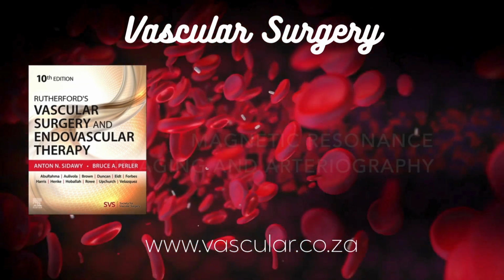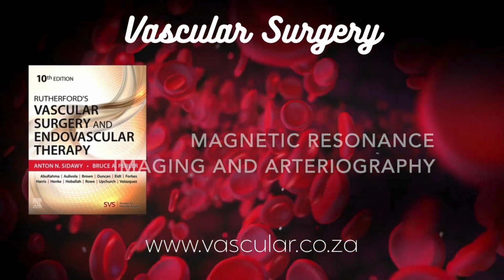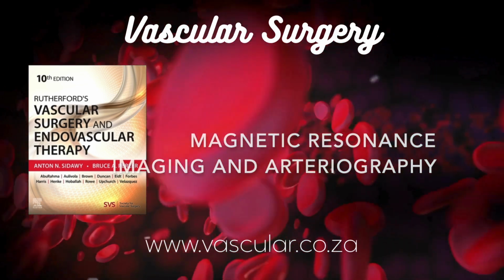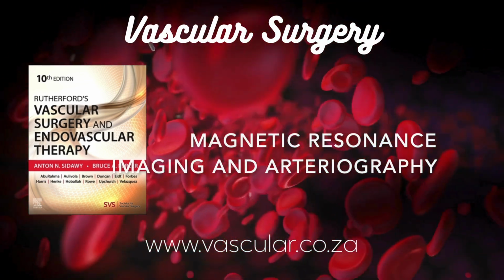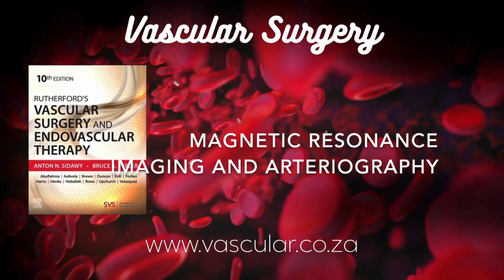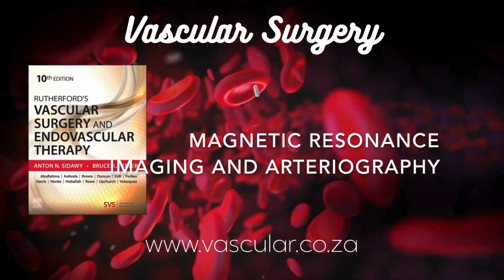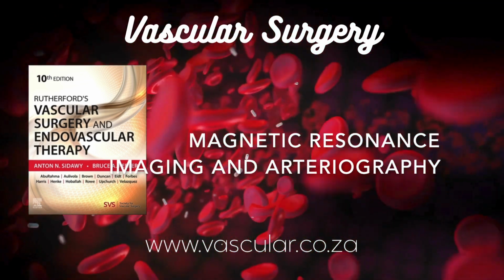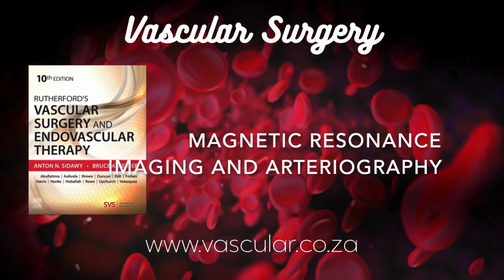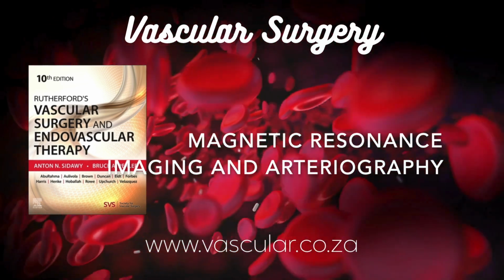Absolutely. They are key determinants of image contrast, what's bright, what's dark. They also massively influence how long the scan takes. For example, T2 weighted images typically use longer TE and TR values, making them slower. But for MRA, you said speed is key. Right. To capture the dynamics of blood flow, especially with contrast, you need speed. So MRA typically uses fast T1 weighted gradient echo sequences that have very short TE and TR values. Get the snapshot quickly. Makes sense to capture the image while the contrast-filled blood is actually flowing through.